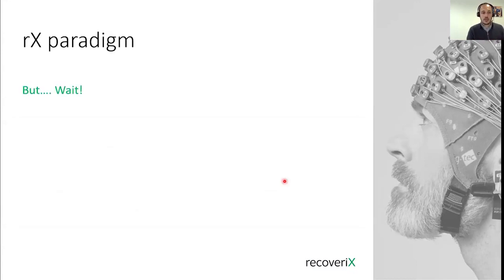So the most important thing now is what exactly it means to imagine the movement. It's very difficult to explain this concept to a patient that maybe lost this function of the upper or lower extremity some years ago, right? Or then maybe in the case of stroke patients, in the case of MS patients, maybe they don't lose the function, but they don't have a normal function in the limbs, right? So what exactly does this motor imagination mean? Imagine the movement. It's very difficult, but I always try to use the same example.